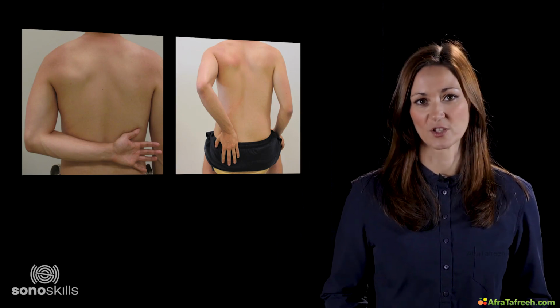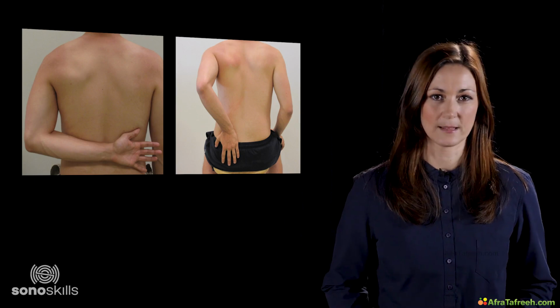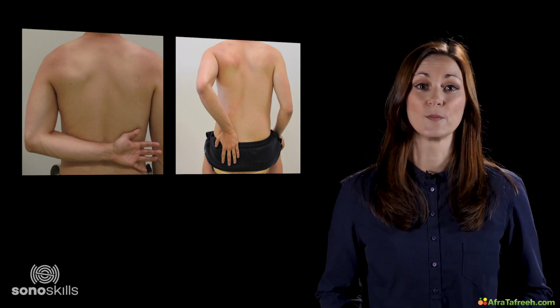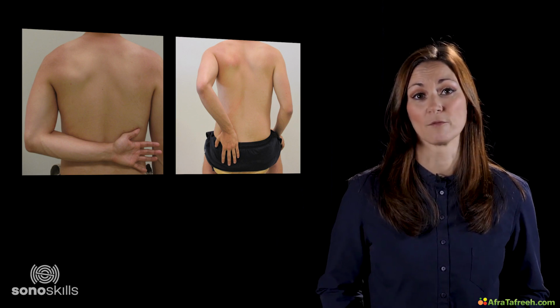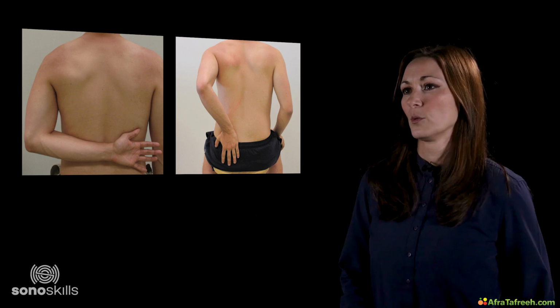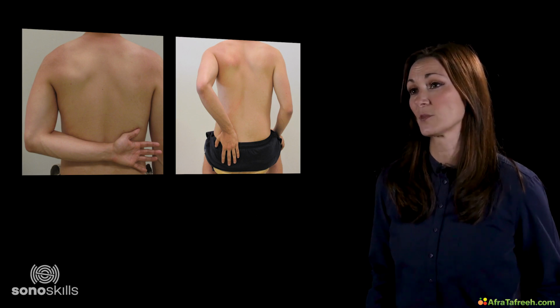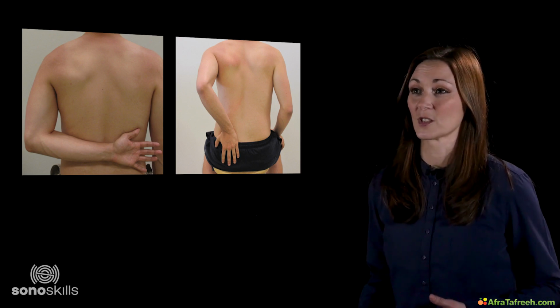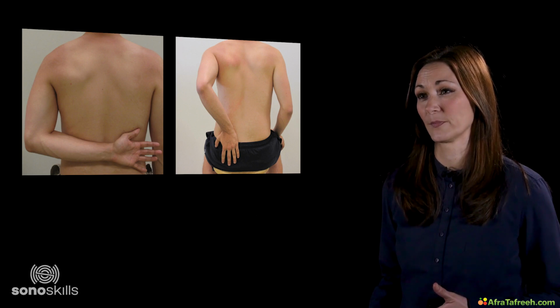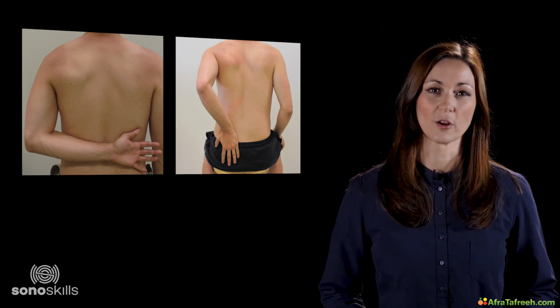The modified CRASS position has the advantage of showing the supraspinatus tendon more completely, extracting the full myotendinous junction, and it also provides a better view of the rotator interval. Both positions are advised when scanning the supraspinatus, as sometimes a pathology is better to see in CRASS position and sometimes in modified CRASS position. Let us have a look at the transverse and longitudinal sonoanatomy.